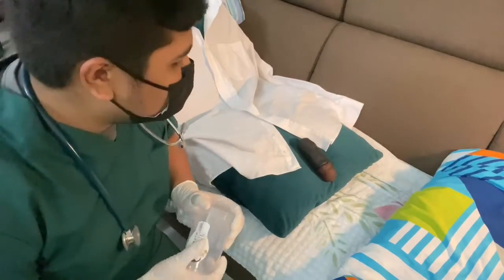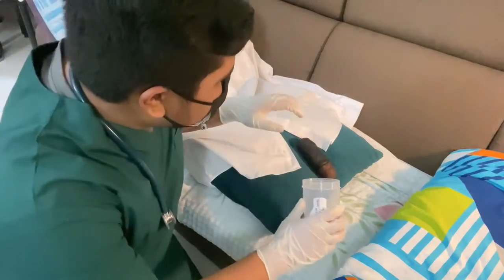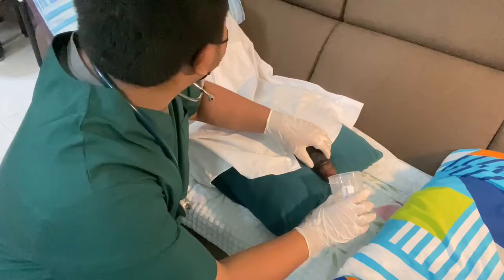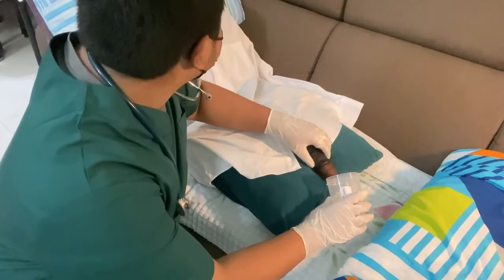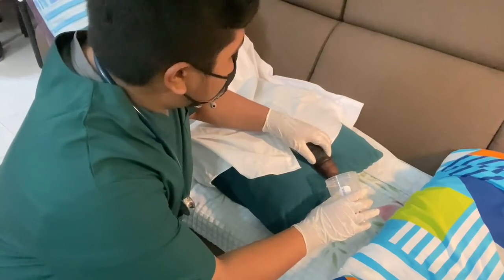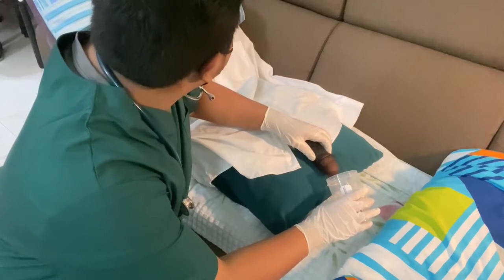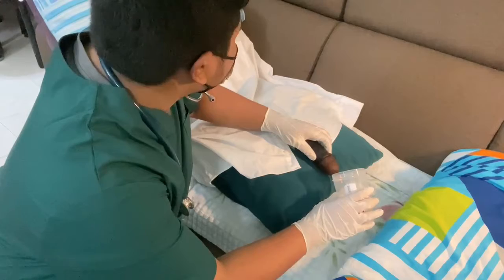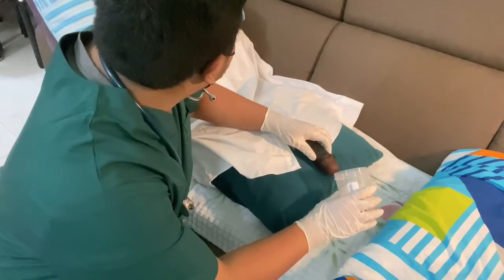So, Mr. Elba, since I'll be doing it for you, I'll be telling you straightforward that this may feel a little bit weird and uncomfortable considering another person is doing it. But I must warn you, the cup is a little bit colder than your body temperature, and you will feel more cold once your private part enters the cup.